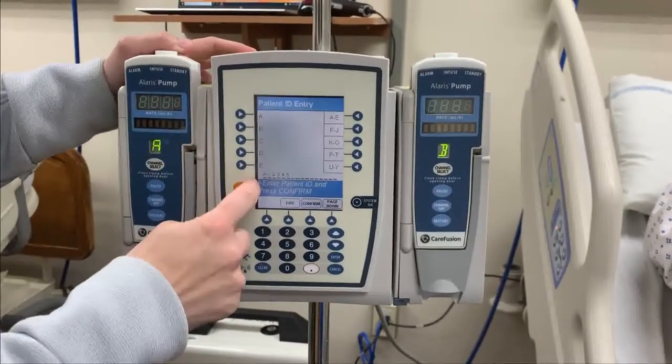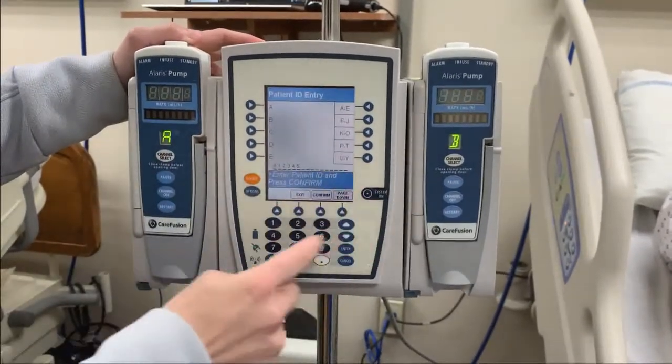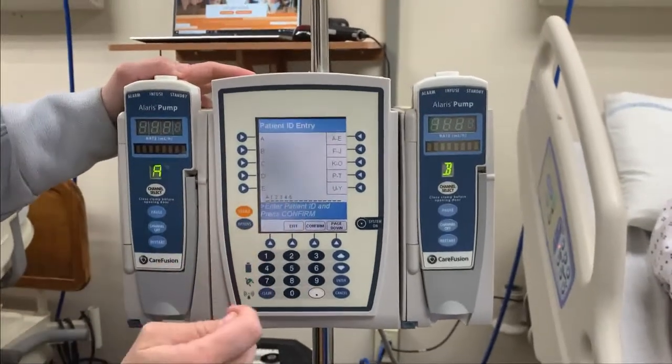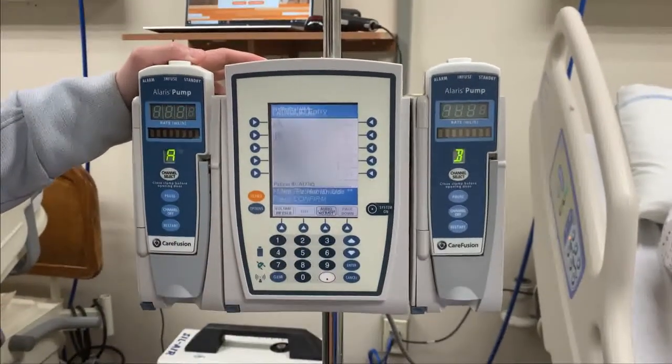Your alphabet letters are here and your numeric values are here. Once I'm good with that, I'm going to confirm that that is my patient.